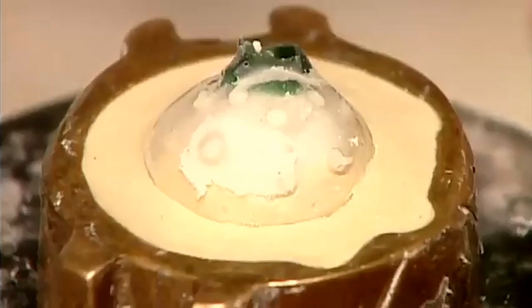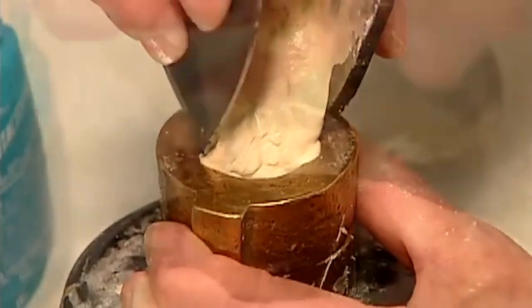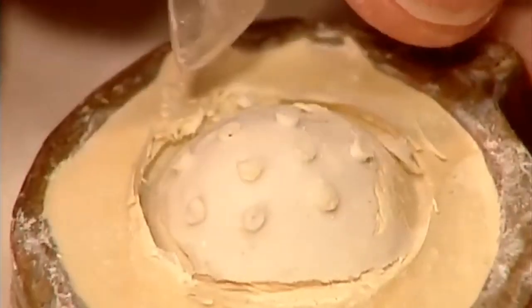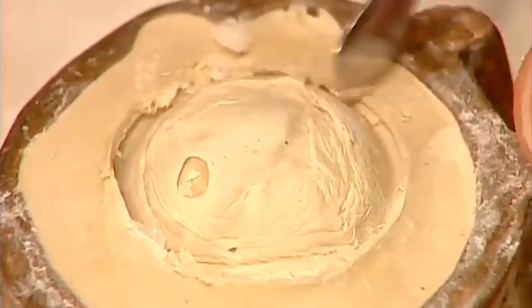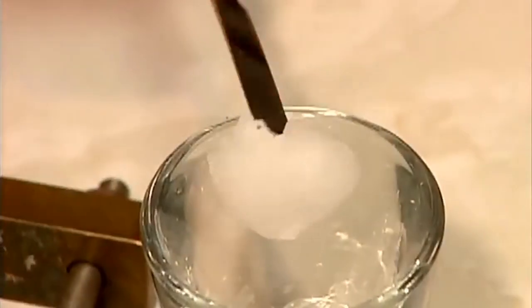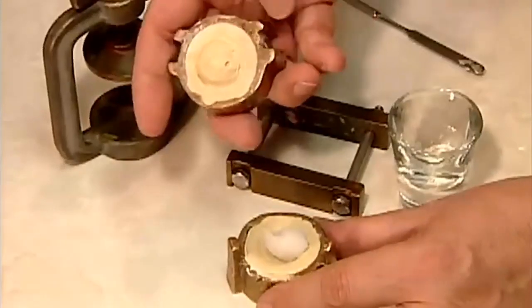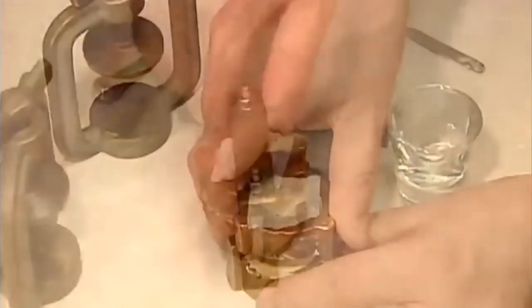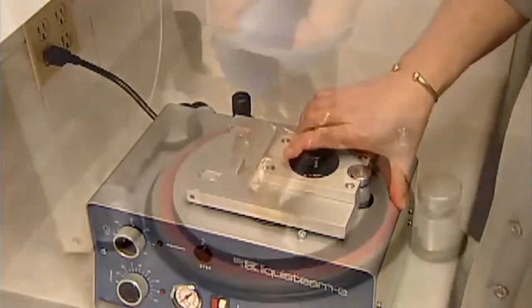They place the impression in a mold and pour in a type of plaster. When the plaster has hardened, they remove the impression tray and then the impression itself. What's left in the mold is a plaster replica of the socket. Now they put a wad of acrylic plastic dough into the mold, lock the mold into a press, and submerge it in a high-pressure curing unit for 25 minutes. Then they cool the mold in cold water.